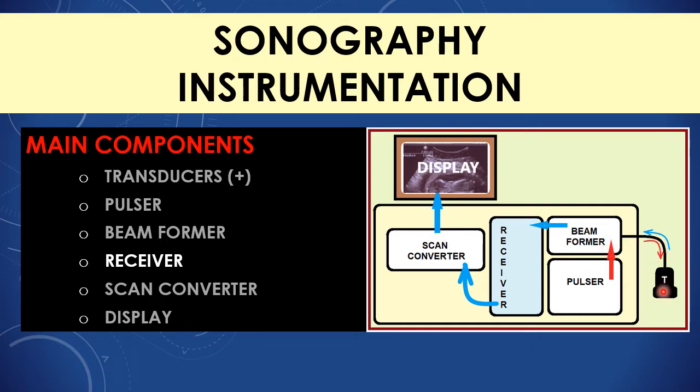The transducer is converting this electric voltage to sound waves. Sound waves are given to the patient. The patient will give reflections back. These reflections will hit the transducer again. They are converted to signals. Signals are traveling as electric signals, I mean, they are traveling through the cord back to the beamformer, and these electric voltages are exposed to the dynamic focusing and the dynamic aperture.